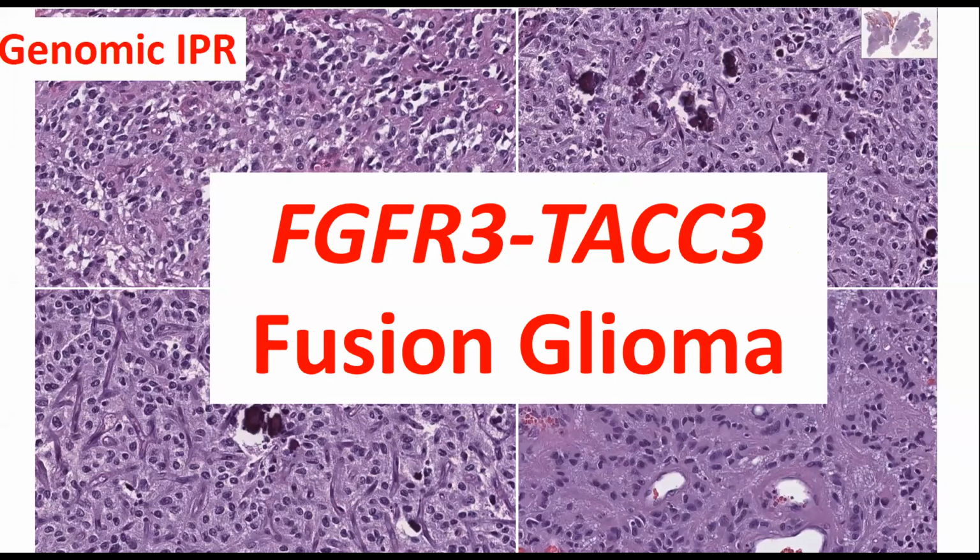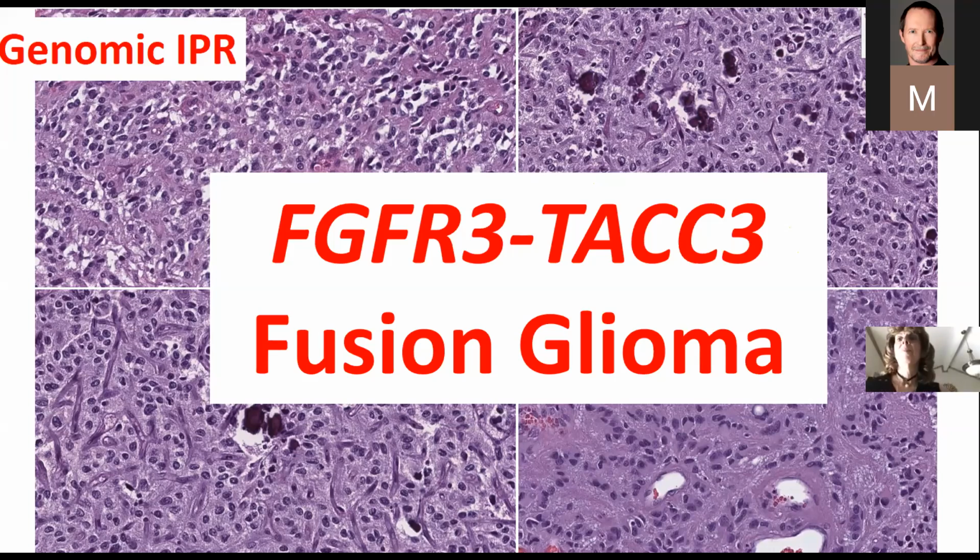If you look at the histology, here are the critical features that should have raised your index of suspicion sky high as to what this tumor was going to be. Number one, in the upper left, that looks like oligodendroglioma. The first thing you should have noticed is relatively regular round to oval nuclei surrounded by cytoplasmic clearing, so-called perinuclear halos. So maybe as a first approach, you're thinking, oh, okay, oligodendroglioma, and the signature is going to be IDH1 or IDH2 mutant and 1p19q whole arm co-deletion, and that would molecularly define oligodendroglioma. But I'm not going to show something that elementary in this conference, right?